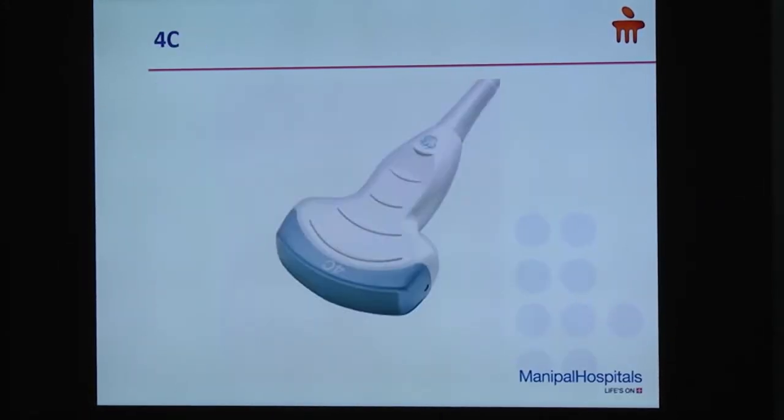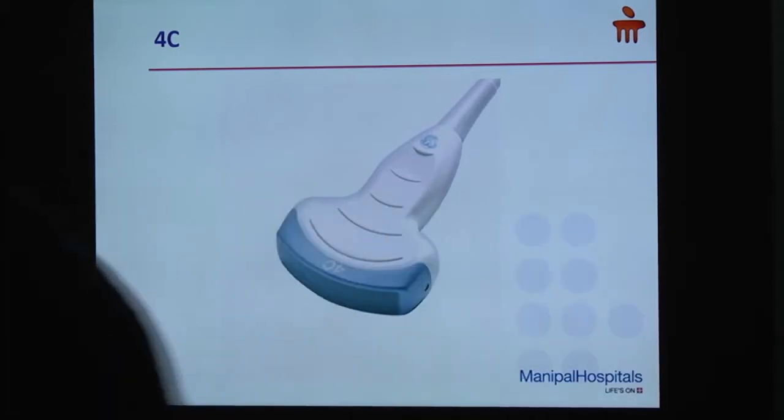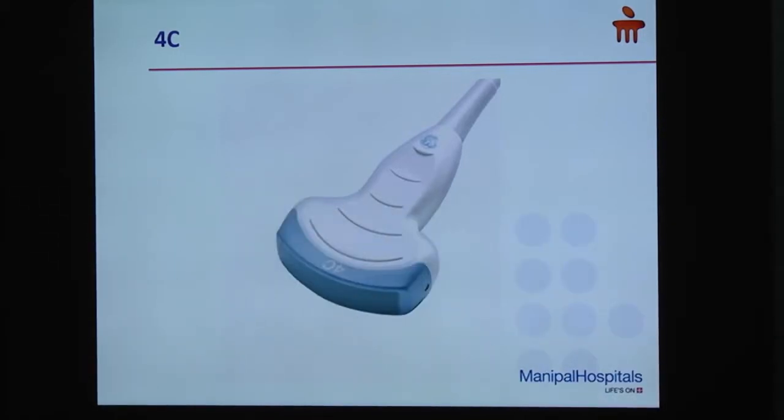The next one, I'm sure you would have seen this probe as well. This is called a curvilinear probe. Sorry, are you able to hear? Yes. Okay. So this is a curvilinear probe. This is an abdominal probe. So it's a 4 megahertz. So it's a relatively lower frequency compared to a 12L or a linear probe. The advantage of this is it goes very deep, even though the resolution may not be as good as the linear probe. So this is useful for studying the deeper parts of the lung.